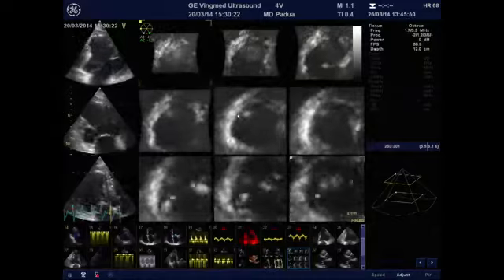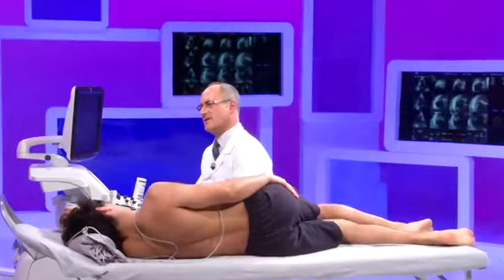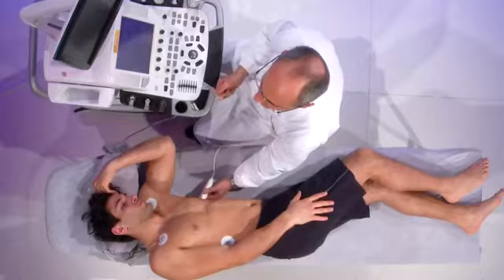However good your examination has been, however careful your measurements, I recommend again not to take what you have measured in this single examination as details to judge the overall function of this transplanted heart.